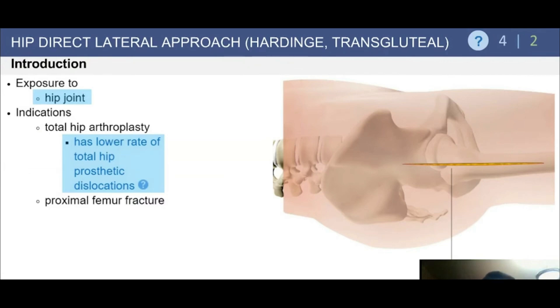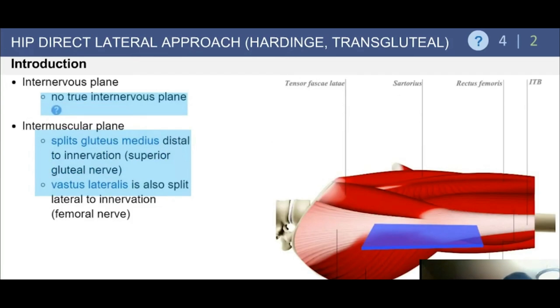The lateral approach provides excellent exposure to the hip joint. Its indications are predominantly for total hip arthroplasty, and it can also be used in proximal femur fractures. It has the lowest reported rate of total hip prosthetic dislocations of any approach in the literature, although its use is declining in North America.